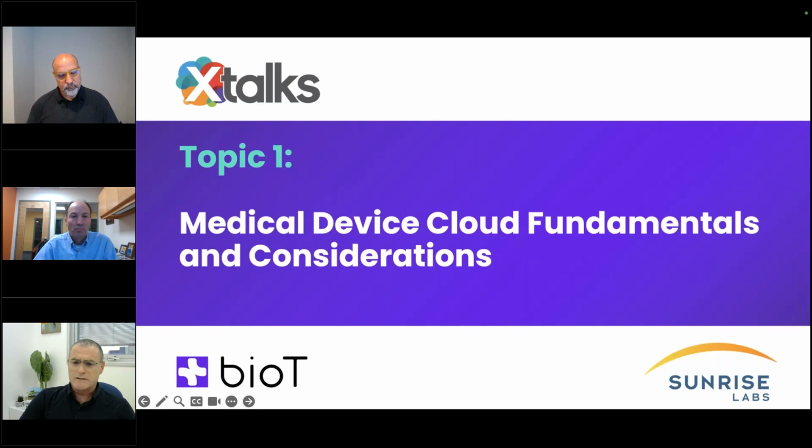The first one is around cost optimization and reduction. Once again, you can use the cloud to make the device itself as simple as possible, or I would call it as dumb as possible, and offload as much as possible to the cloud, running algorithms there instead of on the device, and so on and so forth. So it's an edge device hardware versus cloud hardware or software comparison.